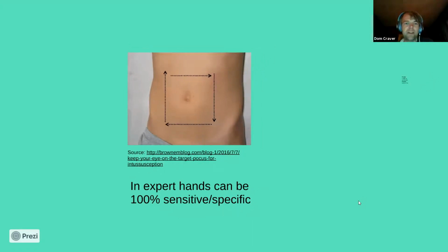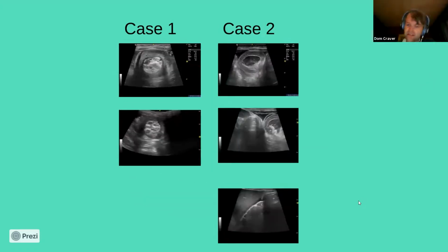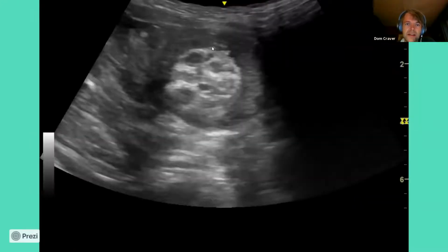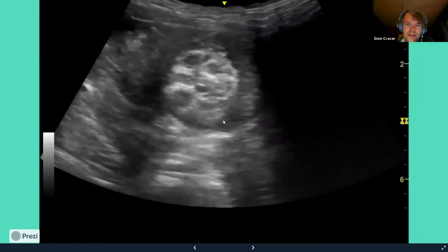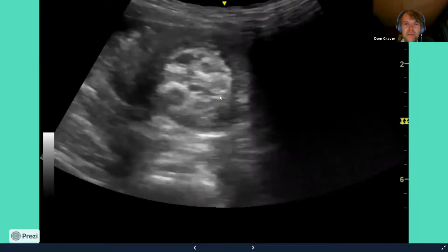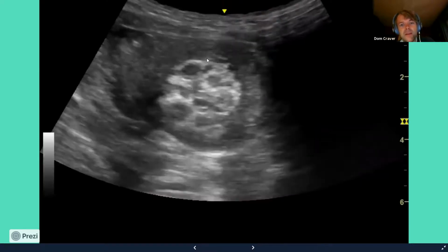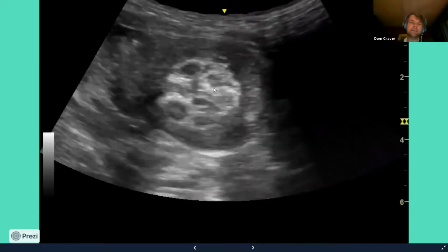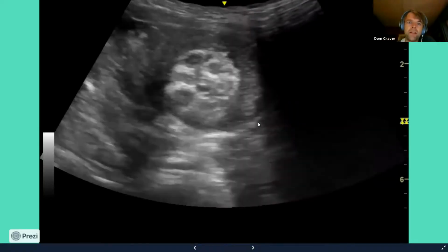So look at the donuts. This is case 1. So you can see this is a still. Let me get you the silhouette. So here we've got a nice donut. So a nice rubber ring on the outside, filled up with some nice jam in the middle. This is a classical picture we get with intussusception. So you get basically the bowel invaginating into itself at a lead point.